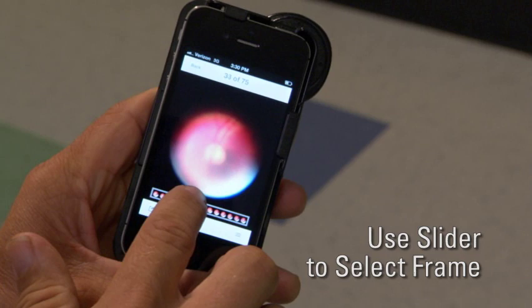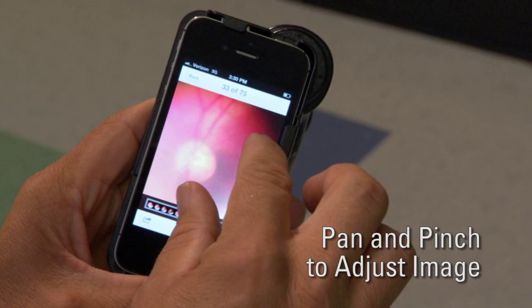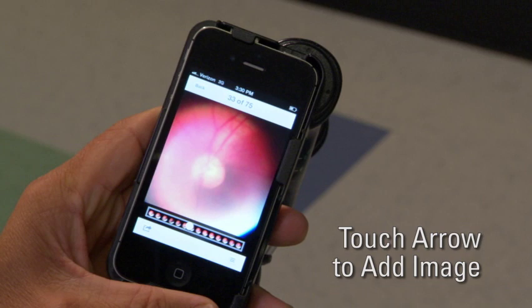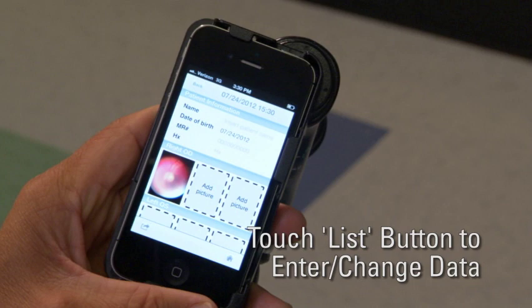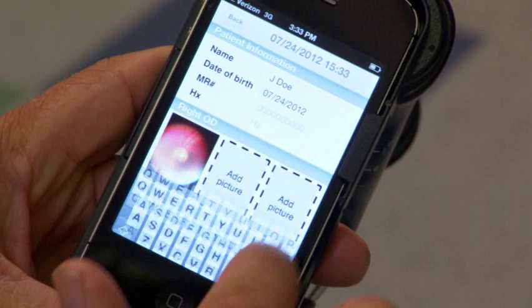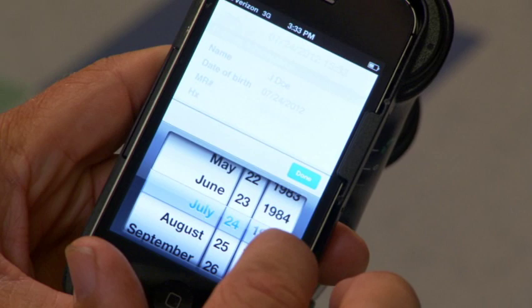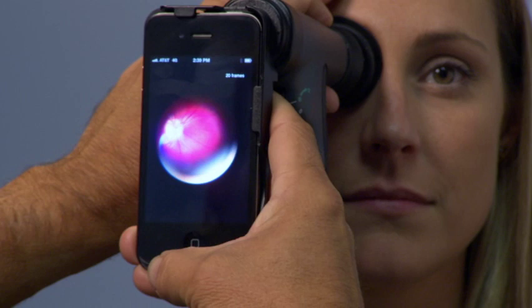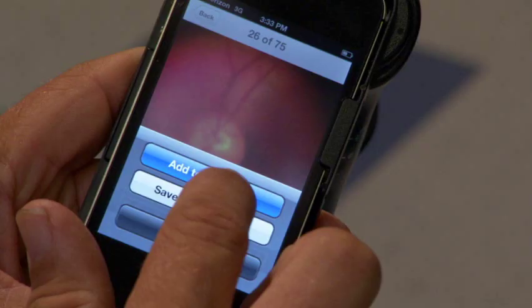Use the slider to select a frame from the exam. Pan and pinch to adjust the image as desired. Touch the arrow button on the lower left of the screen to add the image to a patient's file. Next, touch the list button and select the active area of each field to enter or change patient data. Use the iPhone keyboard to enter relevant patient information. Be sure to touch Done after each entry. Select Date of Birth and use the picker to enter the patient's date of birth, then touch Done. To add more images from the captured exam, simply touch Add Picture and select Images. You can also acquire new images by repeating the exam process. You can save up to three images for each eye.